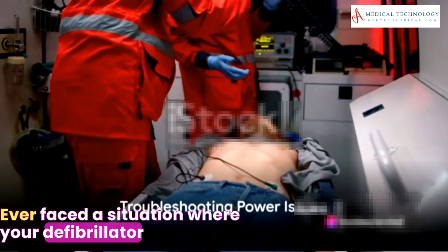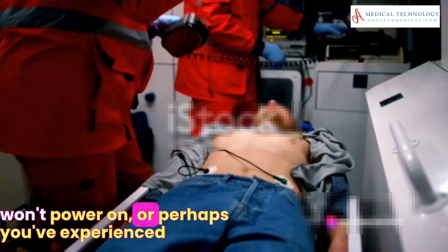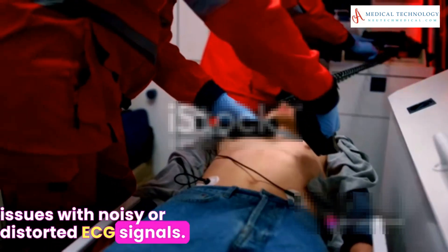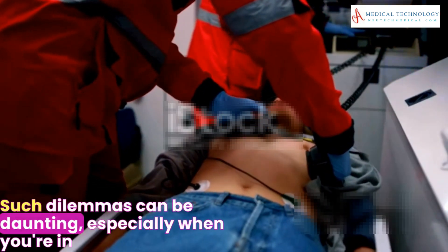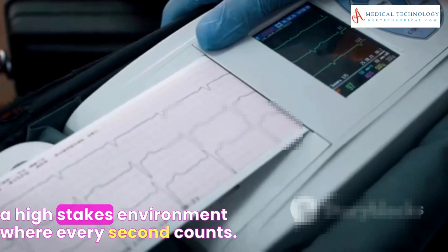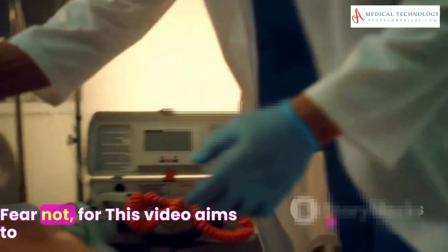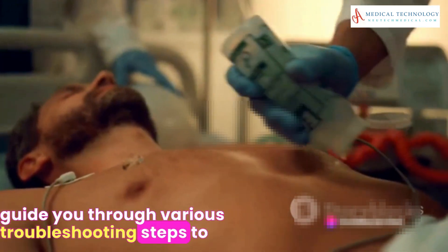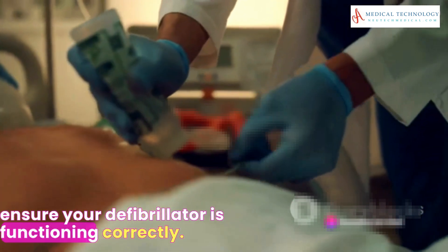Ever faced a situation where your defibrillator won't power on? Or perhaps you've experienced issues with noisy or distorted ECG signals? Such dilemmas can be daunting, especially when you're in a high-stakes environment where every second counts. Fear not, for this video aims to guide you through various troubleshooting steps to ensure your defibrillator is functioning correctly.